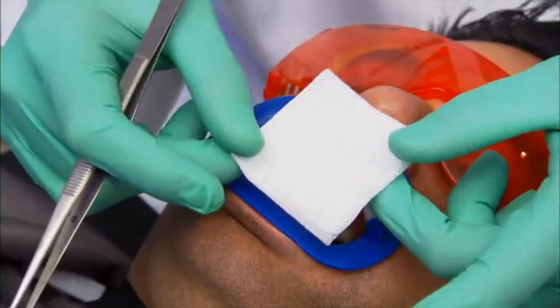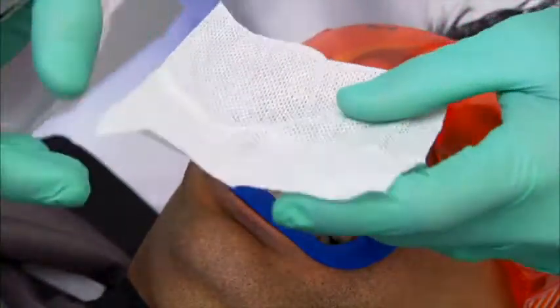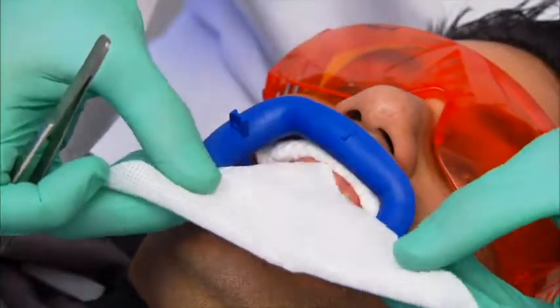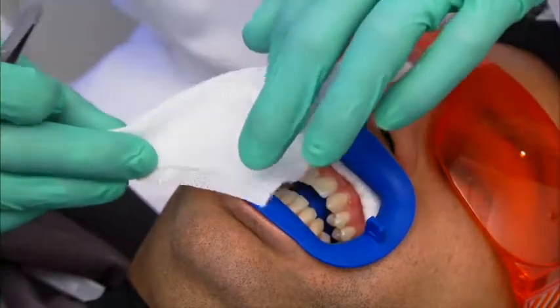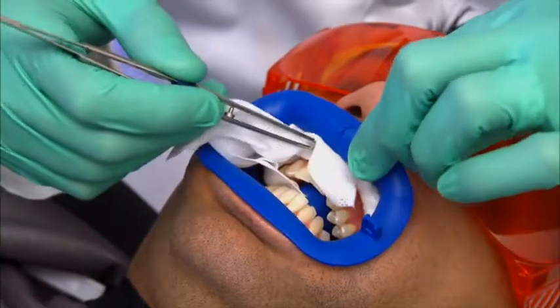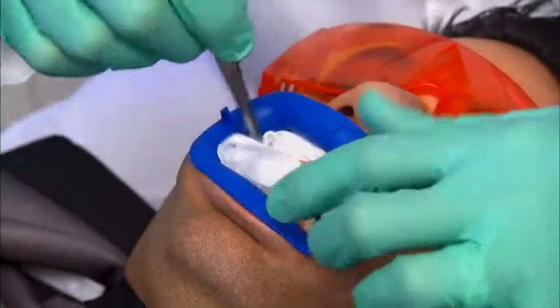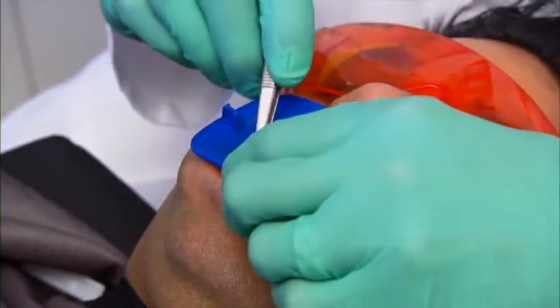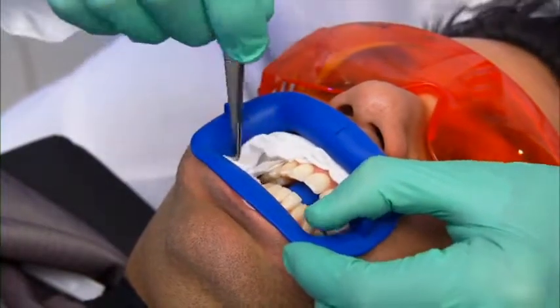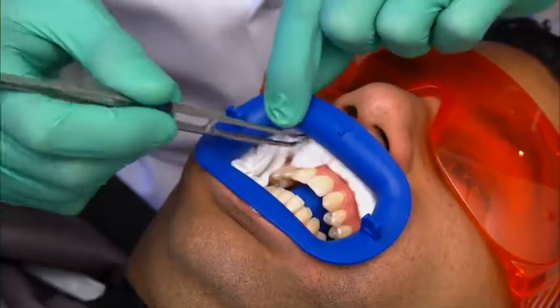Next, isolate with the gauze included in the Zoom kit. Fully open the gauze squares and fold into a triangle. Place the apex of the triangle into the posterior cheek. Tuck the balance of the material into the cheek, tucking ends between cotton rolls and the retractor. The supplied gauze has been tested and is proven to provide superior protection with the Zoom lamp. Do not substitute your own gauze for this procedure.